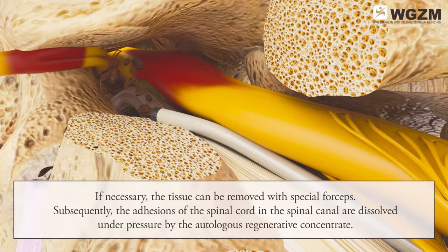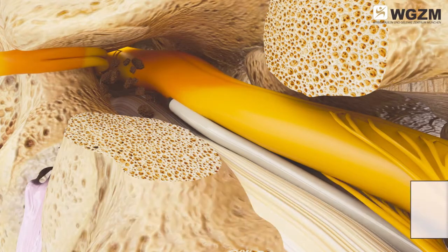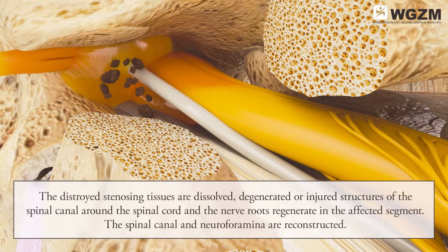Subsequently, the adhesions of the spinal cord in the spinal canal are dissolved under pressure by the autologous regenerative concentrate. The autologous regenerative concentrate is then applied to the damaged areas of the particular segment, and the destroyed stenosing tissues are dissolved.